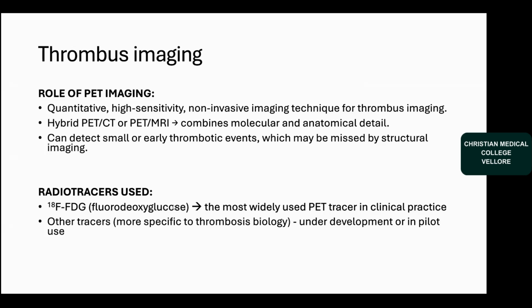So radiotracers used. F18 FDG is the most commonly and widely used PET tracer in clinical practice today. There are many radiotracers specific to thrombus, but they are still under development or in early clinical pilot studies.